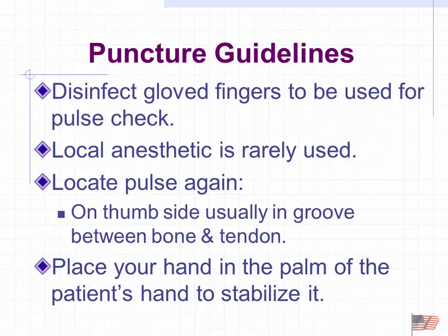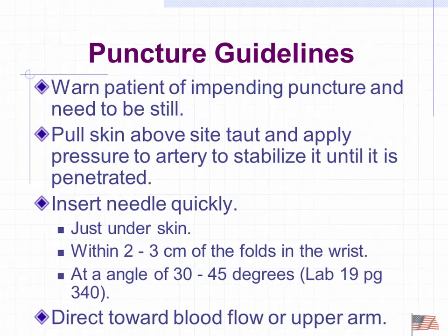We're going to go ahead and locate that pulse, and then we're going to place our hand with the needle into the patient's hand like this. This is so if the patient moves, I move with them. It's not something where the potential would happen that something could become lacerated inside the wrist. Warn patient of impending puncture and the need to be still. Okay, sir, a little poke. I'm lying.